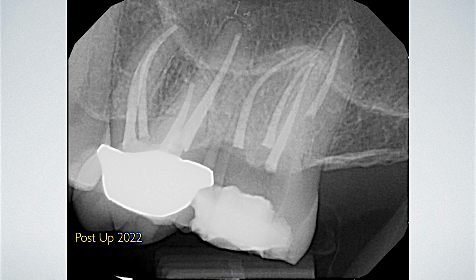On the palatal root, there is a post base that I prepared using the old drill-less post preparation technique, the so-called Nasseh post preparation technique that I described back in 2008 with hydraulic condensation, in which you actually prepare the post base at the time of obturation. You fit your post before you actually obturate using hydraulic condensation, and you segment the gutta-percha at that point. So it allows you to have a very quick post preparation. You can see the video that I made on that in one of the links below.